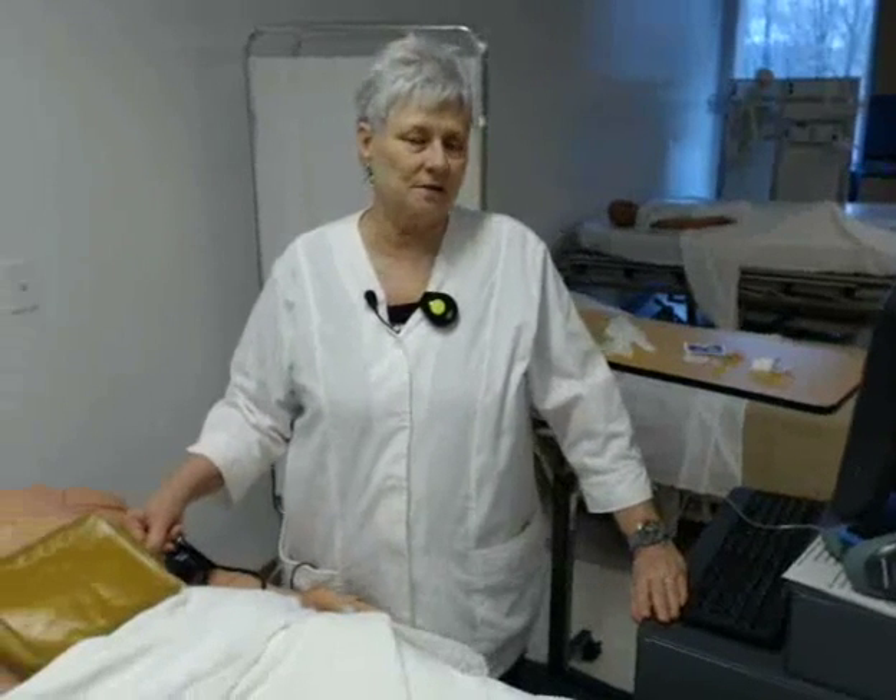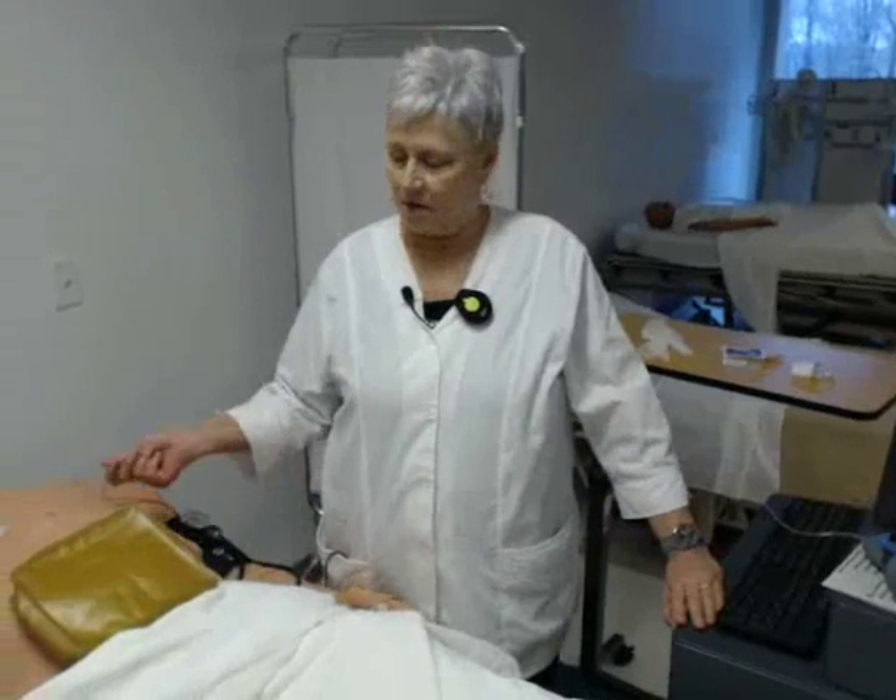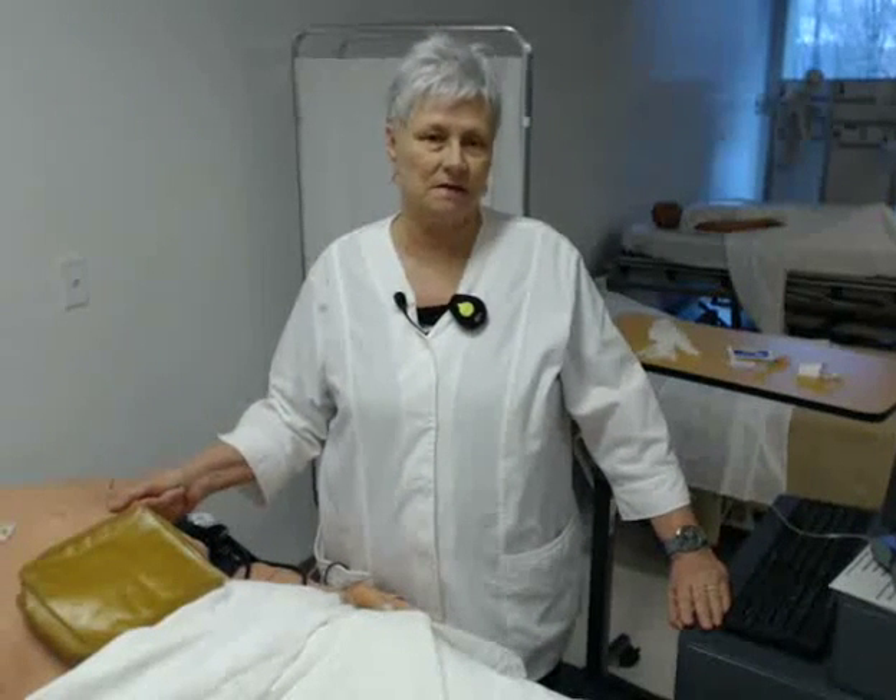This is a demonstration of a subcutaneous injection. I'm here with Mr. Kelly who is going to help me demonstrate this skill.